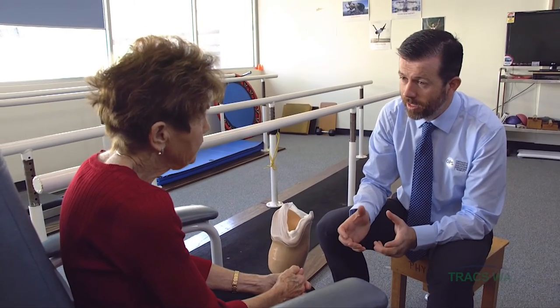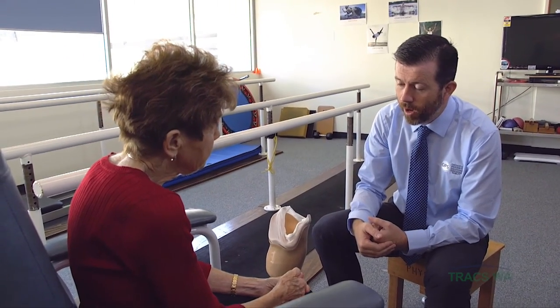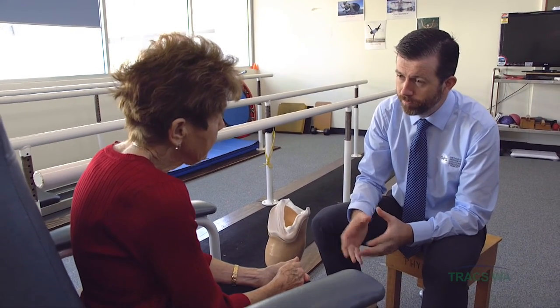A prosthesis needs to be quite tight, and when you're new at wearing one, you can get some swelling back in your leg when you take it off. Wearing the shrinker controls that. In the early stages, where clients wear the prosthesis for an hour or two a day, amputees wear their shrinkers at all other times, including at night. This controls swelling, but also helps control pain and phantom pain through compression, as well as preparing the limb for the compression of wearing a prosthesis.